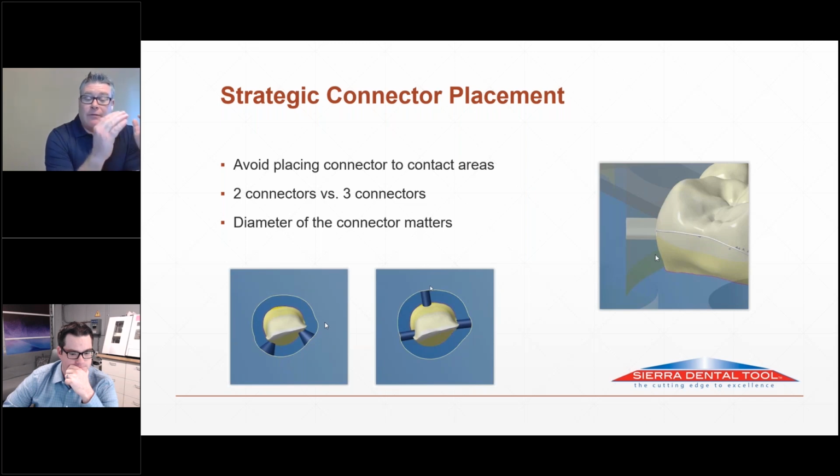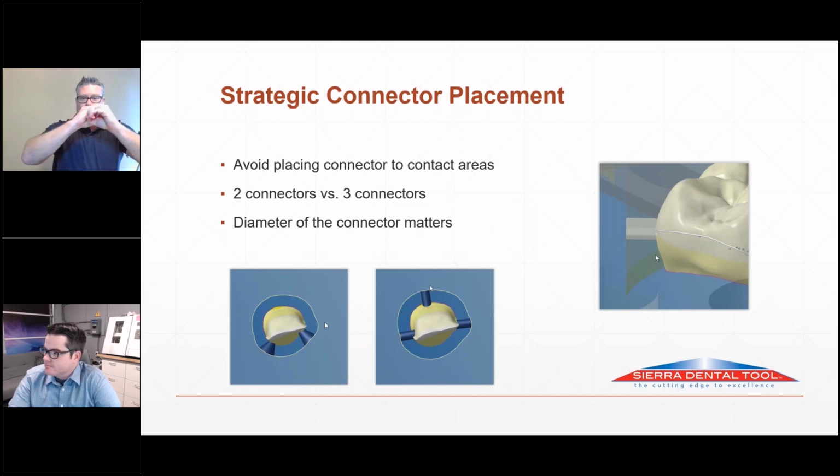That will keep the crown from falling out. You can also overlap nesting them. So overlap them like this and have the connectors on the outsides. And then you can do rows down the center of the puck to start out with. Yeah, it's extremely efficient. They're strong enough.